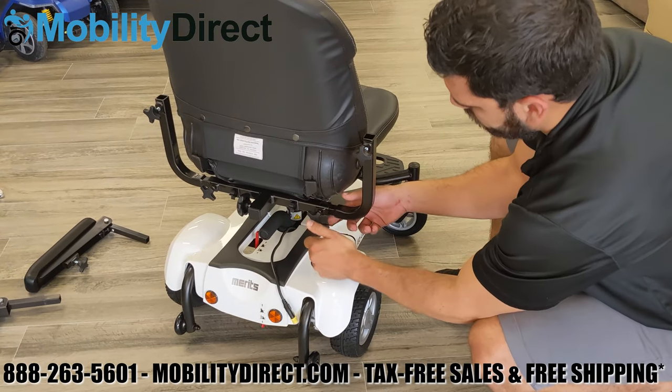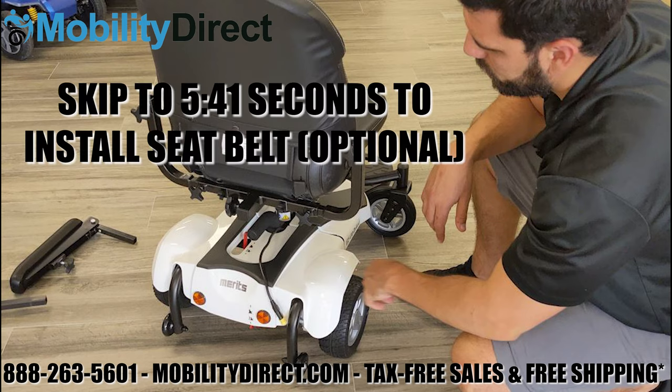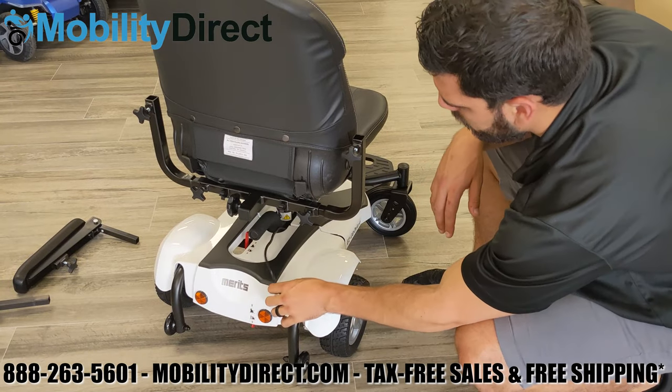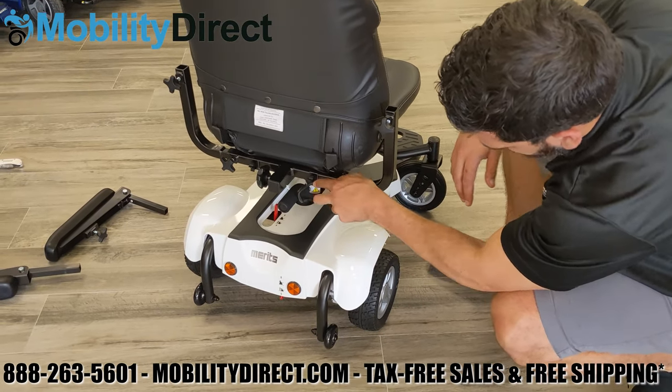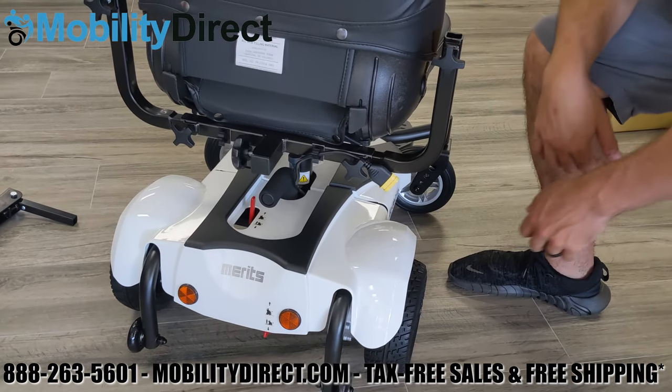Now that you have both of the 90-degree brackets for the armrests in, you may want to skip to the next part of the video where we install the seat belt using the chapter options on the YouTube player. If you want to install the seat belts, you should do it at this point, but it's not too hard to do in the future. You'll notice on the back of the armrest there's a set of clips on each side next to the tension adjustment knobs — those are for the joystick cable.